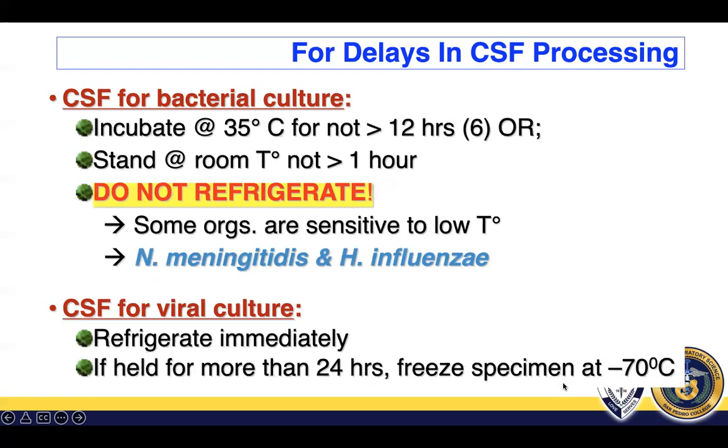Okay. Now for delays in CSF processing, remember that you can always incubate your samples at 35 degrees Celsius for not more than 12 hours in some references and 6 hours in some references, or you can let it stand at room temperature for not more than 1 hour. So this is true for bacterial culture. Remember, do not refrigerate because there are organisms that may be present in your CSF that are known to cause meningitis, like your N.